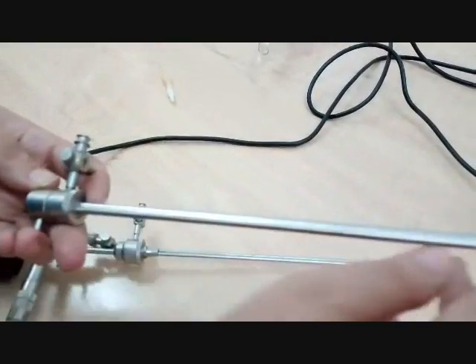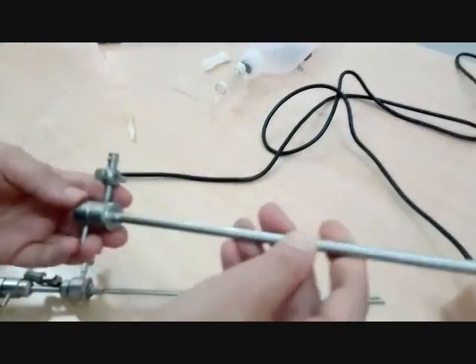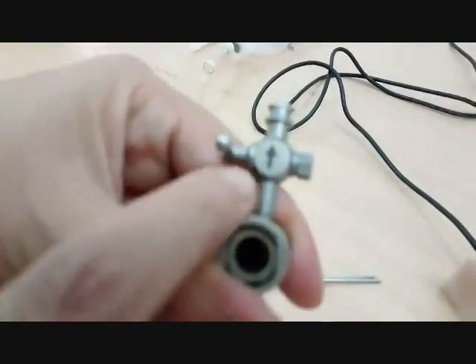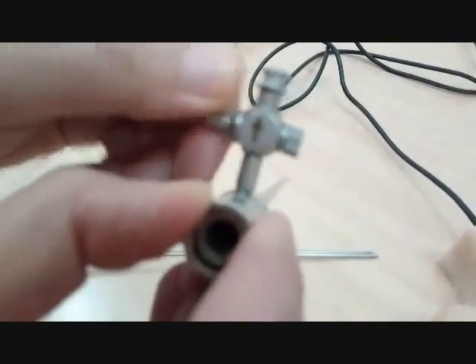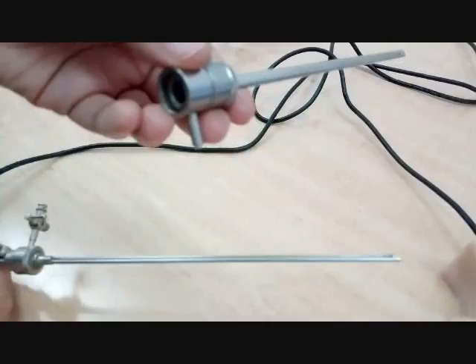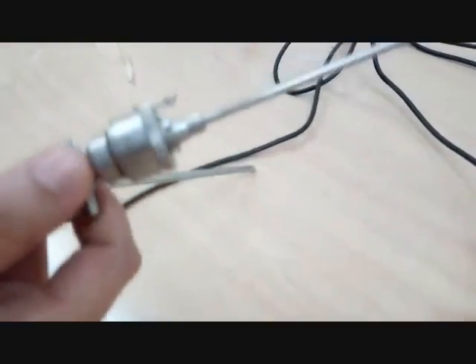Here's the outer operating sheath. It's of a bigger diameter since it will cover the inner sheath and the scope. It has a connector for suction tube supplied with a stopcock too. We're gonna do the assembly exactly the same way.